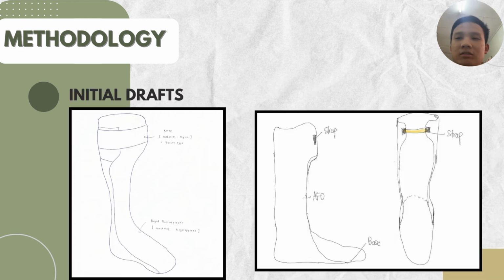At this part, you can see our initial draft that was created by me and my teammates, and have a look.